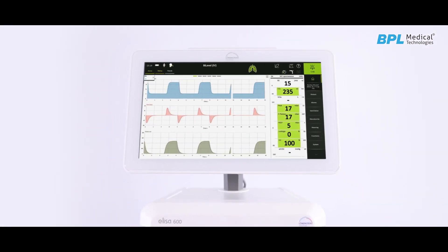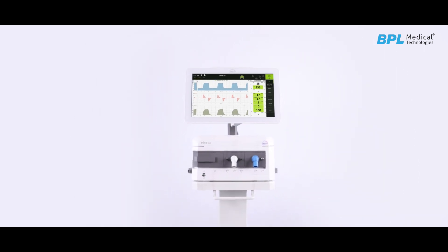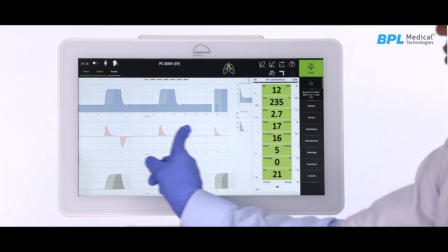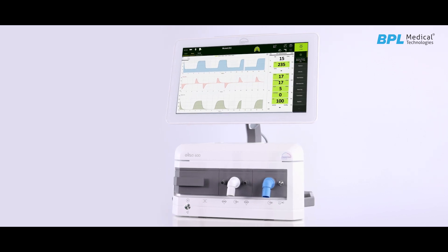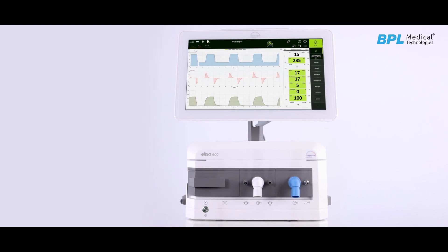Precise, robust and maintenance-free flow sensing technology in ELISA 600 enables measurement of expiratory data for all patient categories without physically changing it. In addition, ELISA 600 can also be used in various modes of operation depending on patient needs.